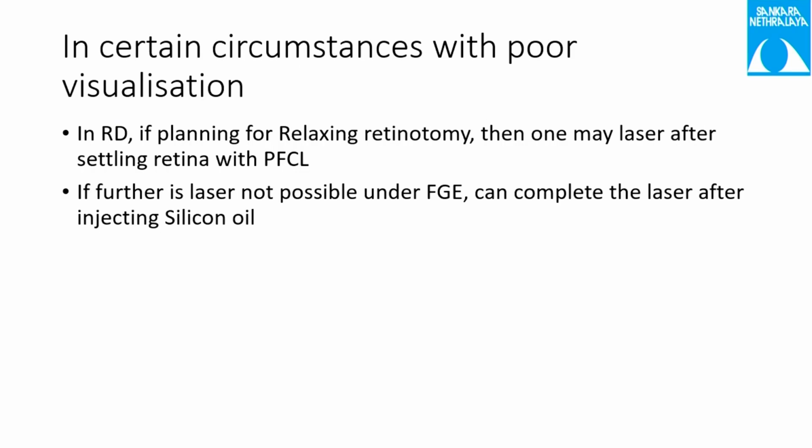So yes, in certain situations where you are planning for a relaxing retinotomy, definitely one might use a PFCL, and under the PFCL, once you have settled the retina, you can go ahead and laser such patients, especially if the patient is having very poor visualization.